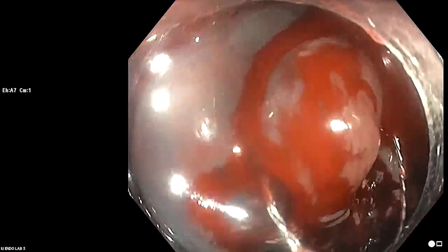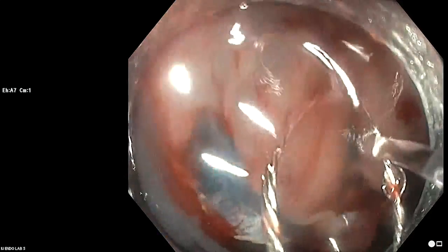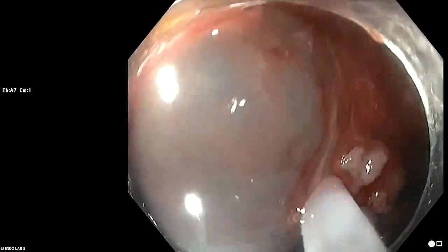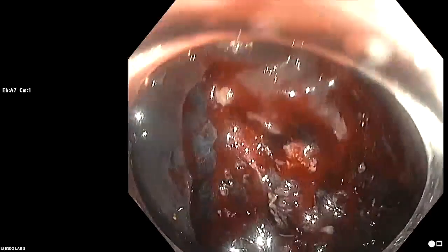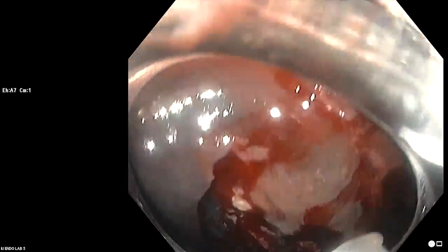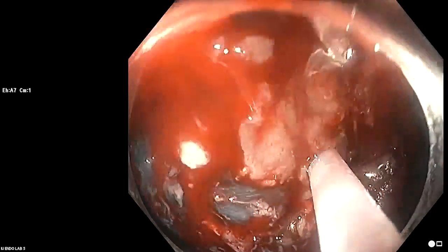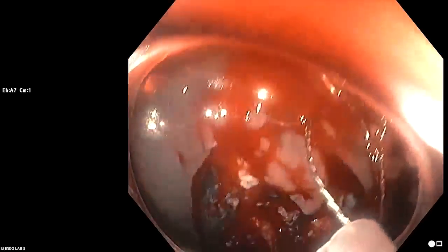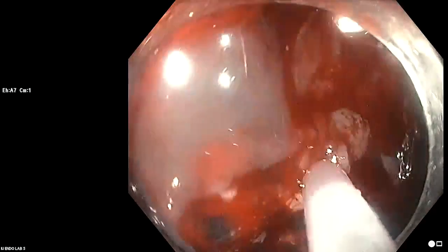It'll almost always, if you don't push on it too hard, I'm just going to put a little water in there to sort of clear up where we are. If you don't push on it too hard, it'll typically last for the entire case. So, the original dedicated cold snare was the Exacto, and for cold EMR, I would definitely use a thinner wire snare, one that has this thinner braid, because you're going to get more drag on the snare if you are using a normal braided snare. You'll have to pull through more often. It's just not as clean and easy.